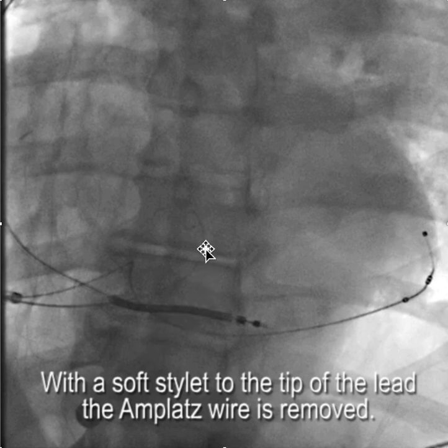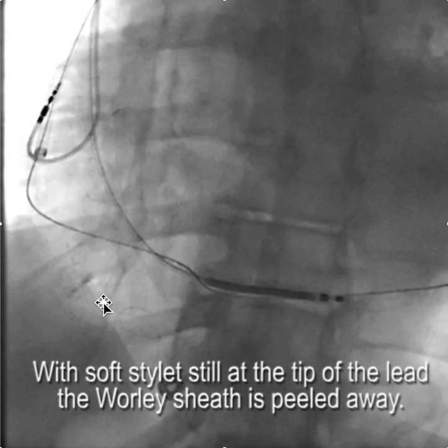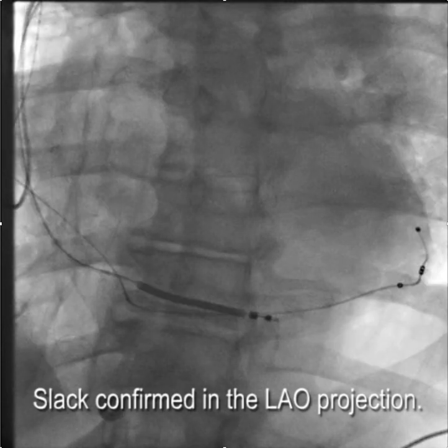The next step is to put a soft stylet to the tip of the lead for stability, and then to remove the amplatz wire. This is the amplatz wire here coming out. Once the amplatz wire is out, we still have the stylet to the tip of the lead, and now we're going to peel away the Worley sheath. It's always important to check the slack in the LAO projection to make sure you have enough slack — and we do. And now we have a complete system.